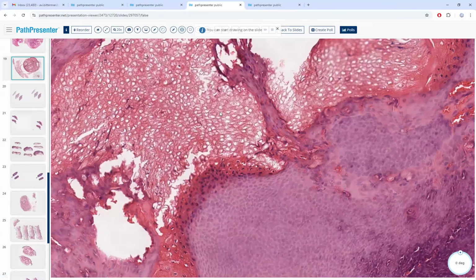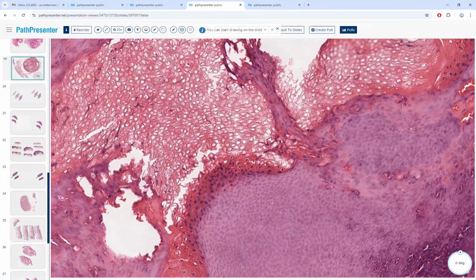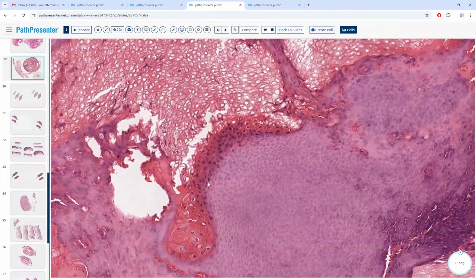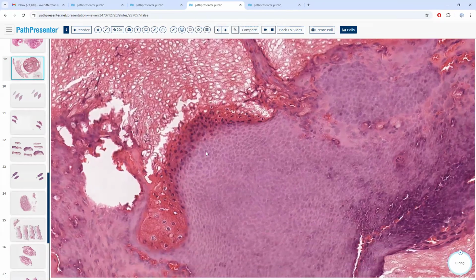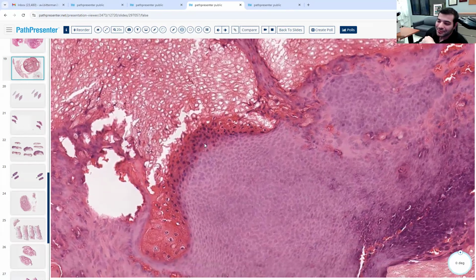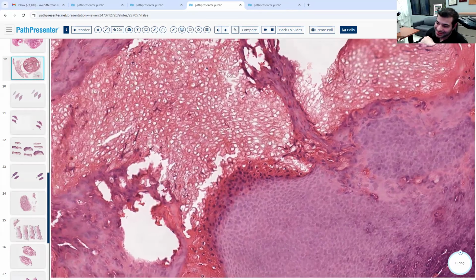But ghost cells has multiple different meanings depending on what entity you're looking at, right? There's ghost cells in the context of pilomatricoma, but there's also ghost cells in other contexts. What context is it when we have matrical tissue dying into ghost cells?